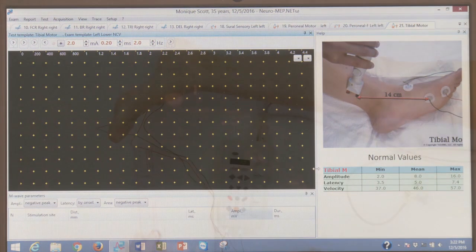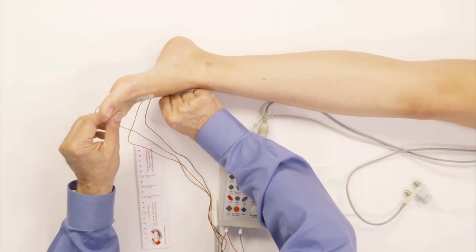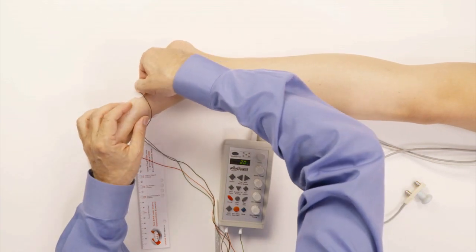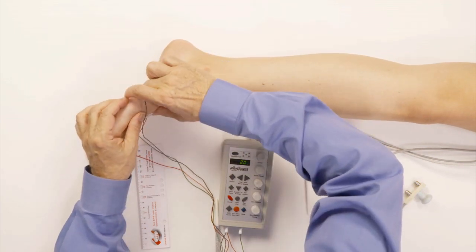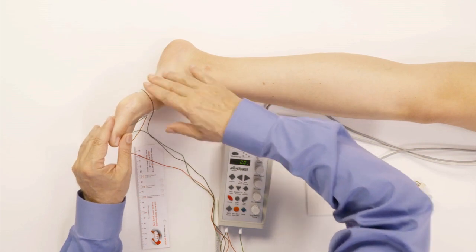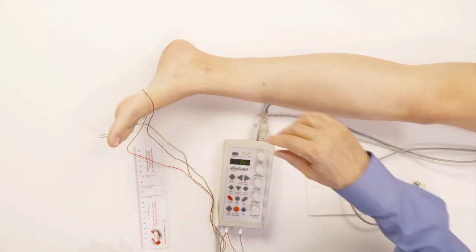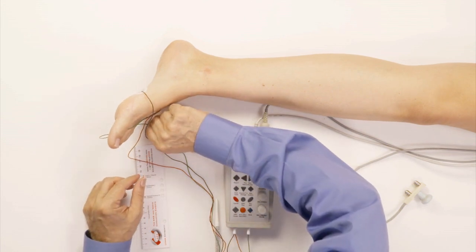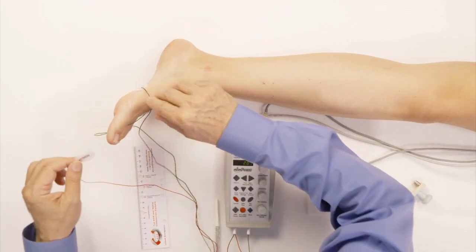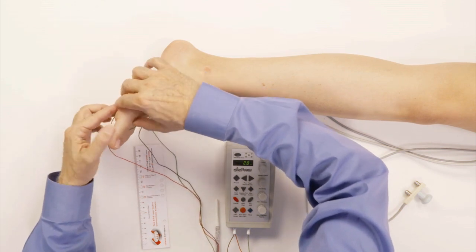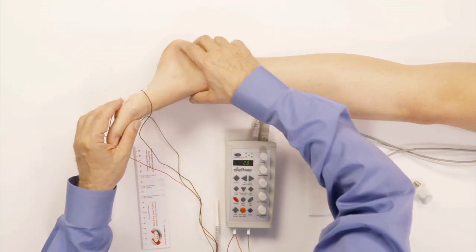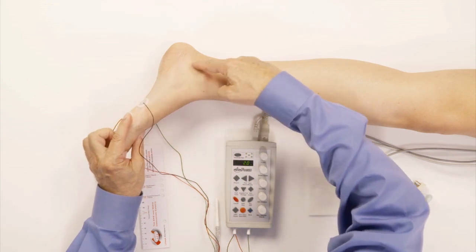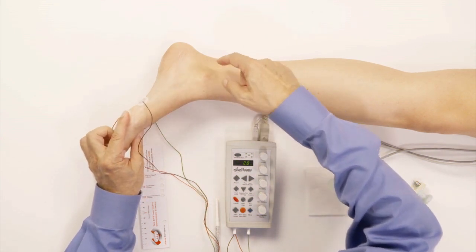I'm going to take the electrodes from where they were here. This is where the abductor hallucis muscle is. We call it abductor hallucis, or AH. We're going to put the red electrode right here on the bone itself.